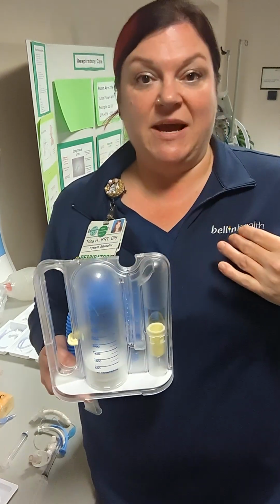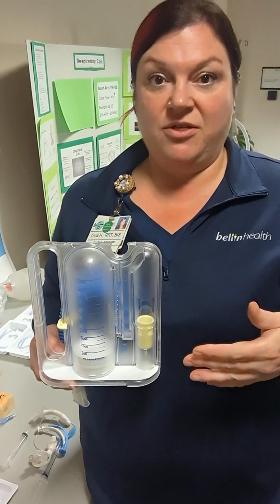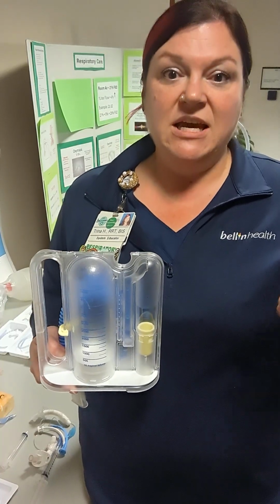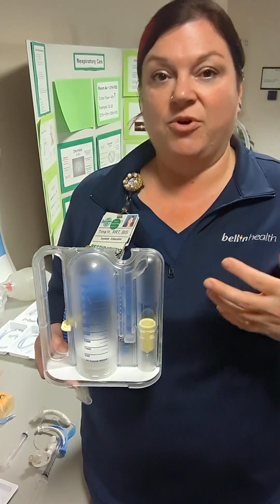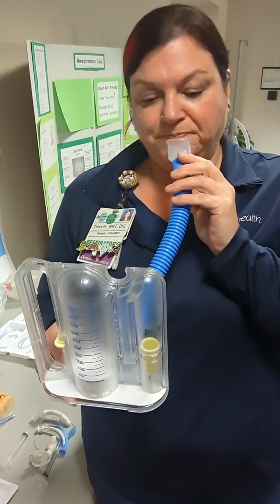And so I would expect that on my good days, I would be able to reach 1,800 doing a slow, deep breath and holding it. Now, our patients come to us and they're sick, right? Or they've had surgery, and so they are not going to be at their peak performance. Keep that in mind, because we want to be sure that we're encouraging them, but we're not pushing them towards an unrealistic goal. So, slow, deep breath, right?